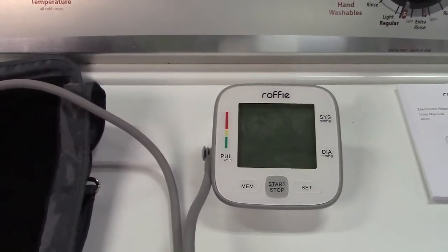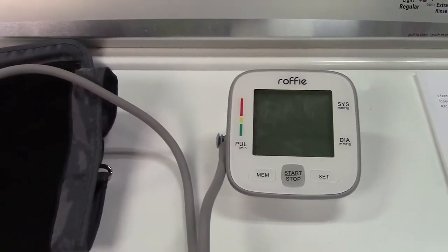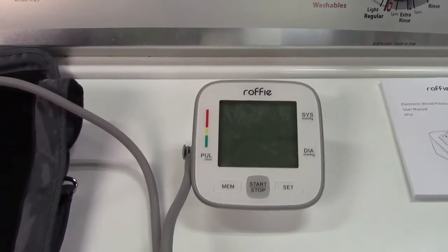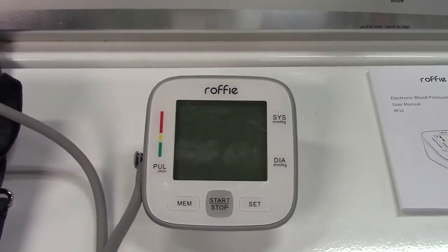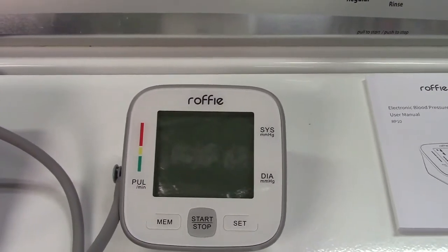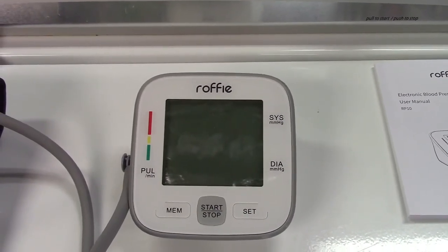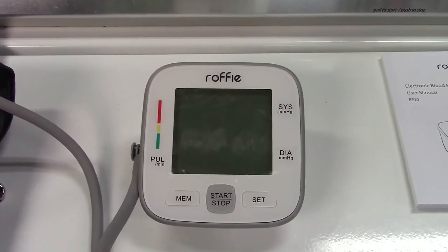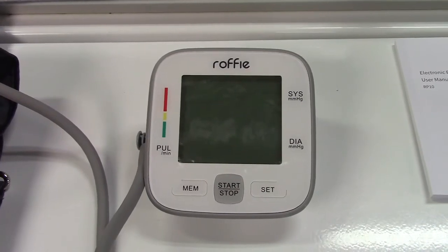You can't beat how easy it is to use — just put it on, hit the button, and it goes. That's all there is to it. You can refer back to the stored data and even bring it to show your doctor or make your own chart. It's all around a great blood pressure monitor by Roffie. If you'd like to purchase this item, I'll leave a link in the video description where you can find it available for sale on Amazon.